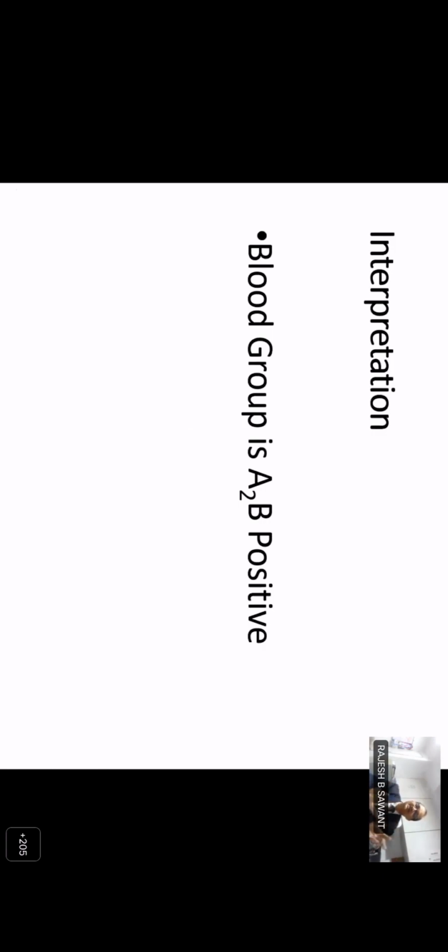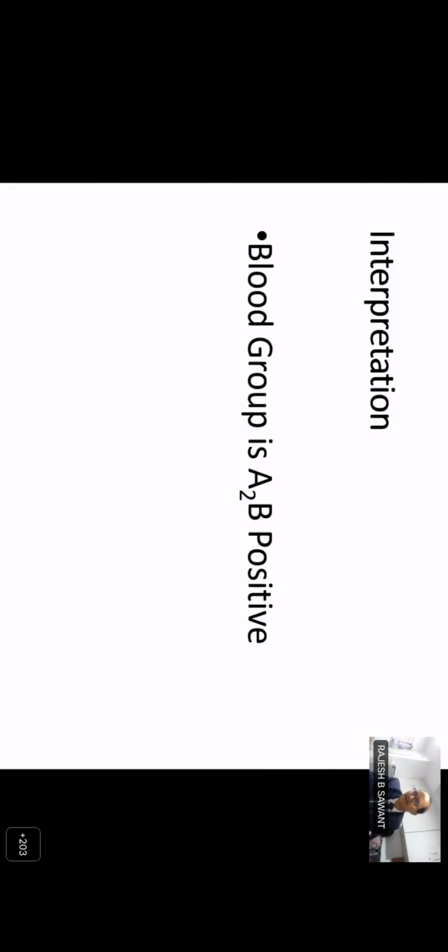Right. So when we deal with such discrepancies, the first take-home is that you have to do a forward as well as a reverse blood group and match the results. The practical issue around blood grouping is that at least once every month we get cases where a person comes to the hospital for, say, blood grouping and a health check, and when they get our results, they say, all my life I have had this particular blood group in my ID card and all my records, and now you are saying my blood group is something else. We have to go back and collect a second sample just to rule out a wrong blood in tube. But whenever we repeat the blood group, we find that whatever we have reported is correct.